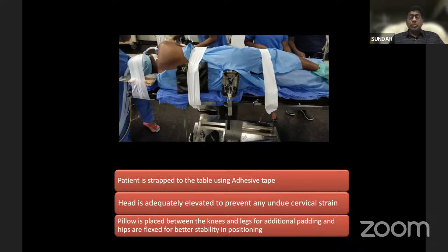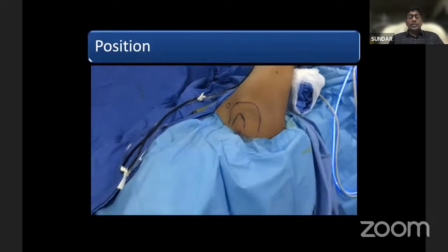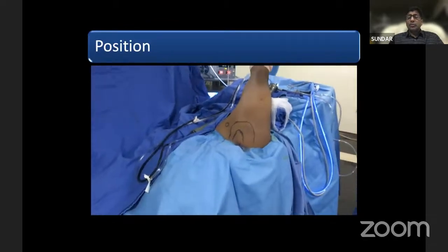And the pillow should be placed beyond all the bony points or the pad points. You should not have any problem with the bony points. And the opposite arm is kept in the rest position like this, so that it helps the anesthetist to access the BP cuff and the IV line. And this is the typical position which you see in the lateral position.